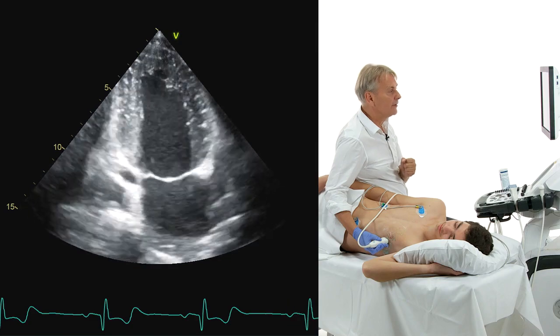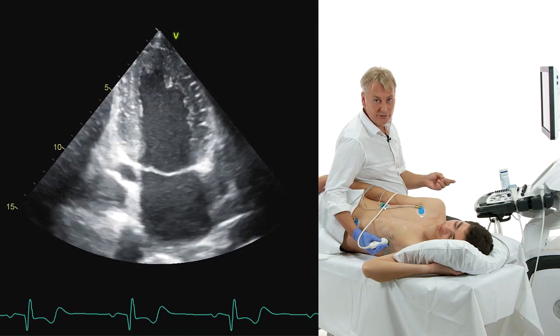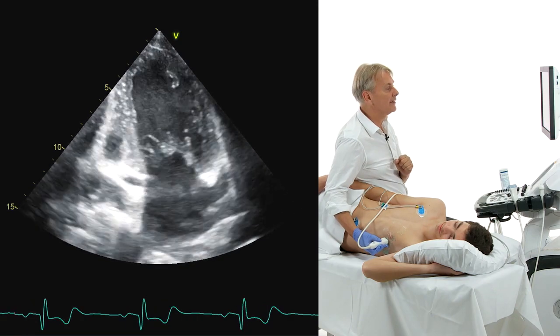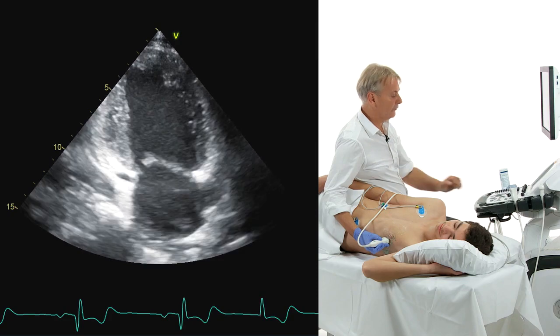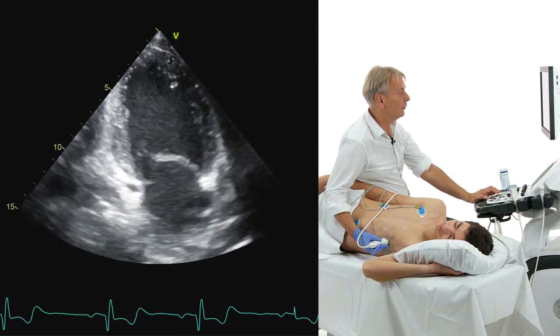When do you reach the two-chamber view? Well, obviously, you're not going to look at the angles. You're going to look at the image, and you're going to find the two-chamber view as soon as you do not see the right ventricle anymore. So in this case, there is no interventricular septum, and you know that on the right-hand side, you have the anterior wall, and here is the inferior wall.